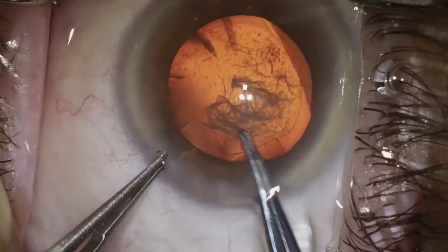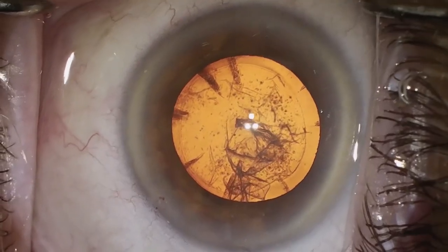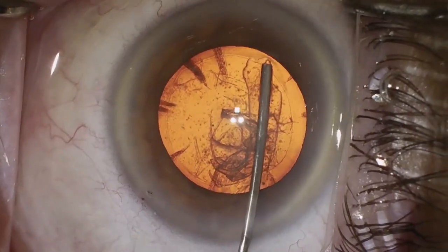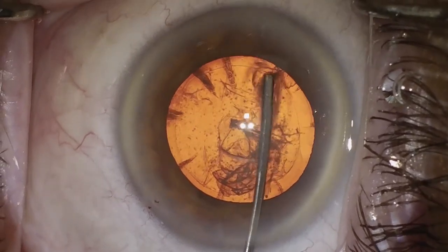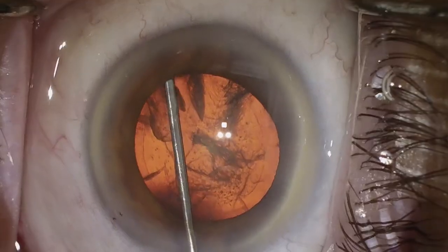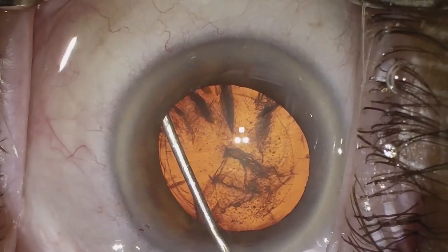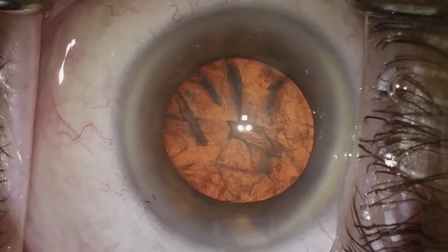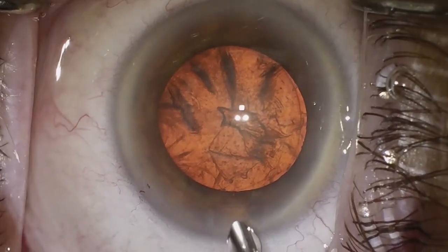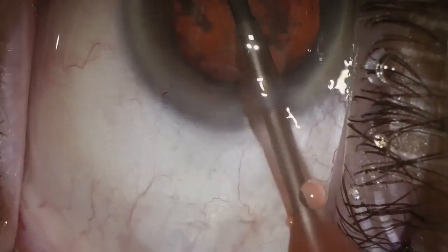We'll go ahead and do a cortical cleaving hydrodissection next. We'll use BSS on a flat cannula, and we'll go ahead and raise the capsular edge. And you can see there's some mechanical separation between the capsule and the lens. And once we're sure we're in the right plane, we'll go ahead and inject. We'll do one continuous fluid wave, and that is it. We'll come in next with our phaco probe, and we will do phaco chop in order to remove this nucleus.